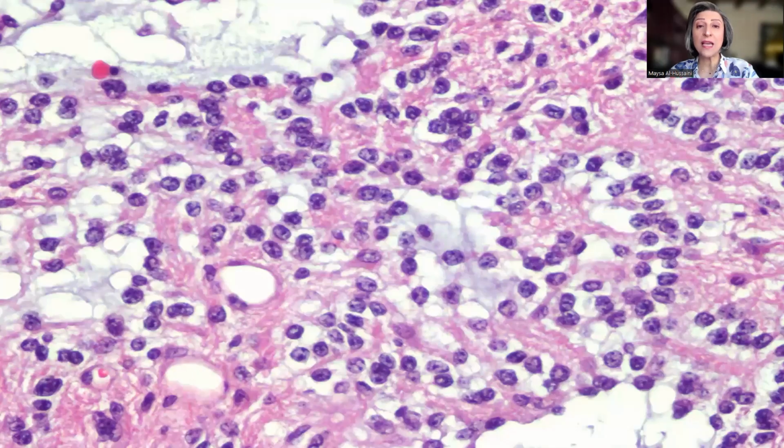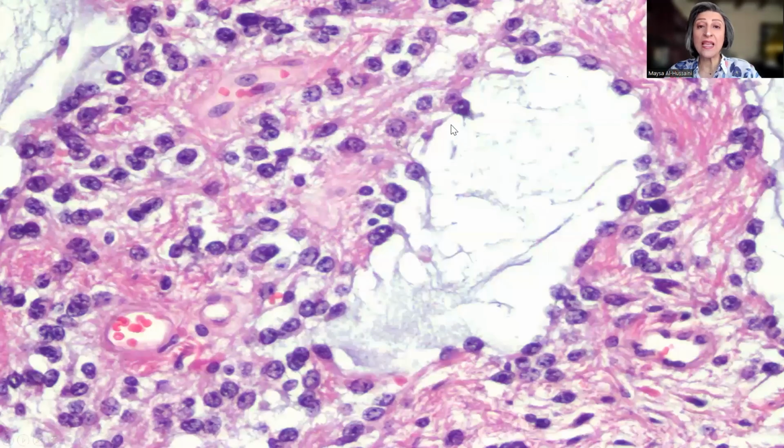Now, for the permanent section, as you can see, the tumor was actually biphasic, and it showed areas resembling this area with microcyst formation here, here, and here, and then cells with vesicular nuclei, not much in the way of piloid cytoplasm. They are very monotonous, and there was no evidence of mitosis or necrosis or apoptosis. Again, another focus of the microcystic areas with myxoid degeneration in the background, some hyalinization of the vessels.